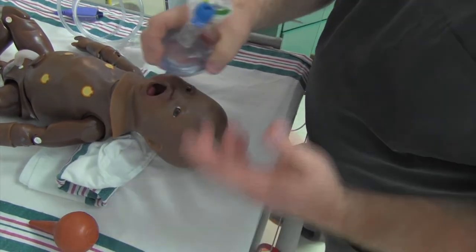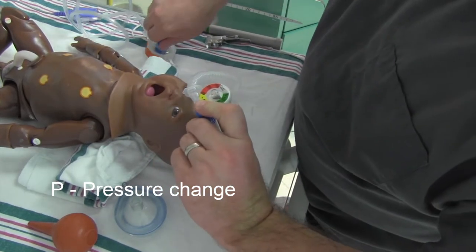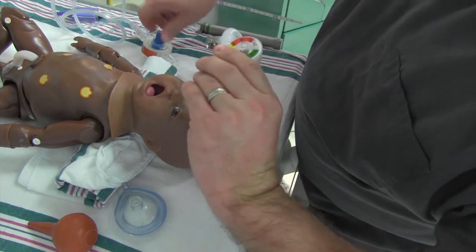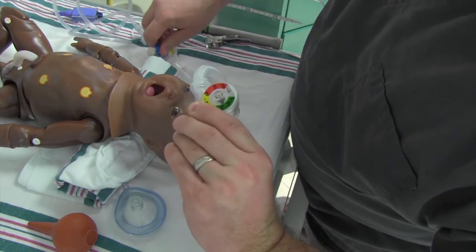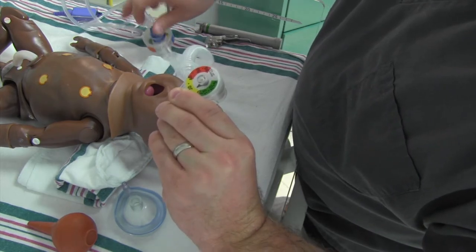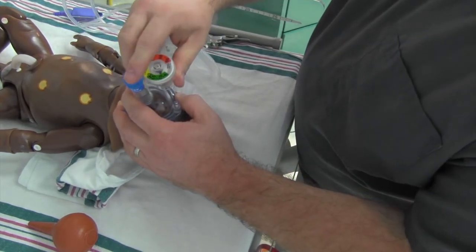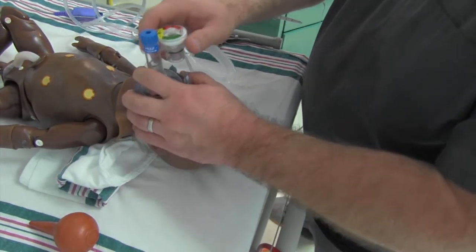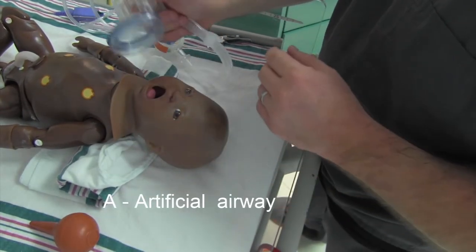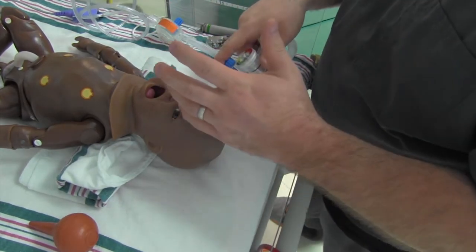Not getting anything there. The next one is P - that's actually increasing pressure. So we go over here, occlude, and crank up the pressure a little bit. Let's say I was at 20 - I go up in my pressure to about 30. Not super common to do - we can increase the pressure. And I'm still not getting the ventilation. The last thing after P is A - so that's artificial airway. That's when we would go to use an artificial airway and intubate the kid.